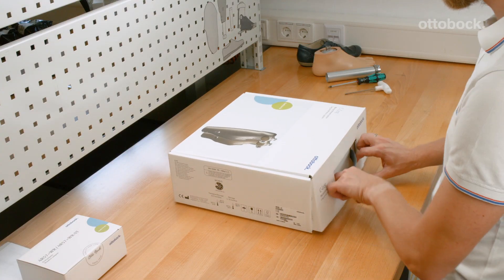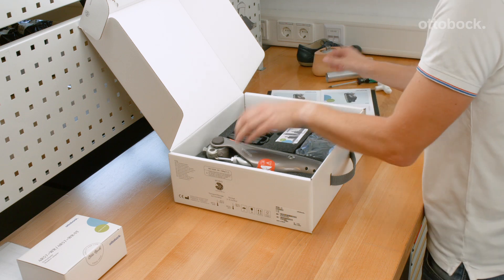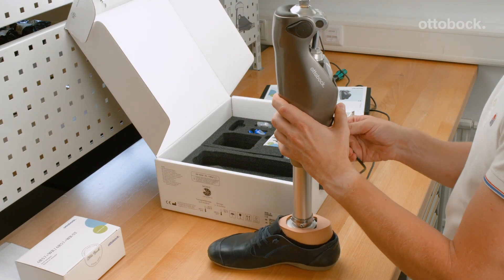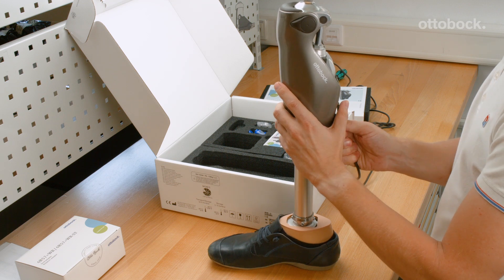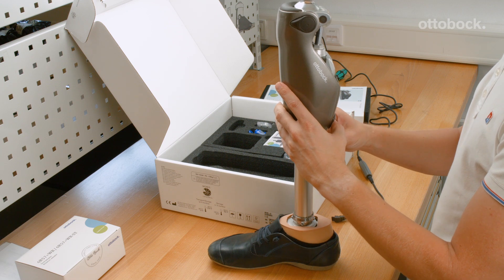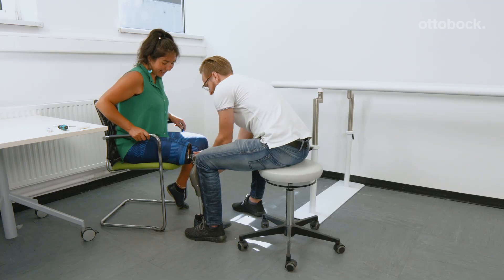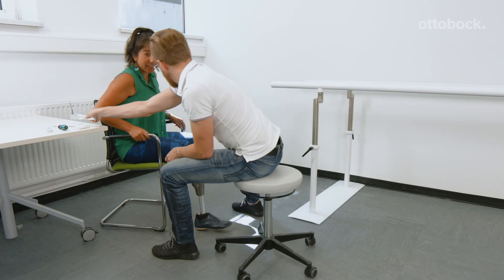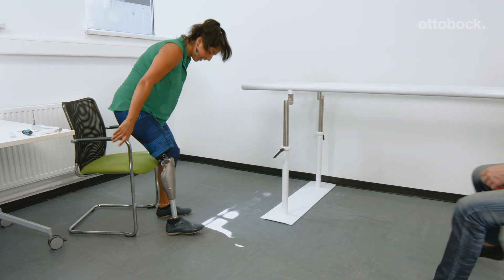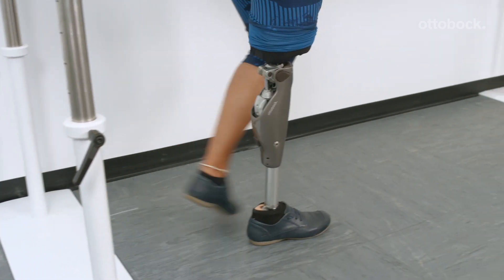Providing the best possible fitting for the user is the goal of every CPO as well as Ottobock. Our microprocessor controlled knee joints adjust their behavior according to the user data entered in the adjustment software. To support the CPO in providing an optimal fitting, we have changed the factory default behavior of the C-Leg 4. It does not release into swing phase unless the necessary user data has been entered into C-Soft Plus.